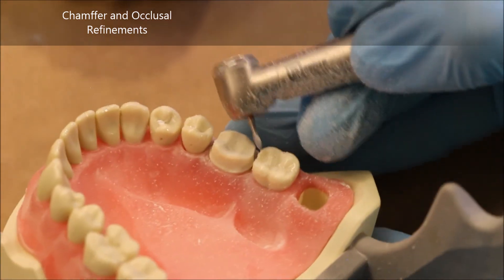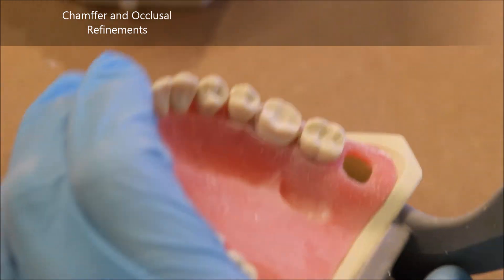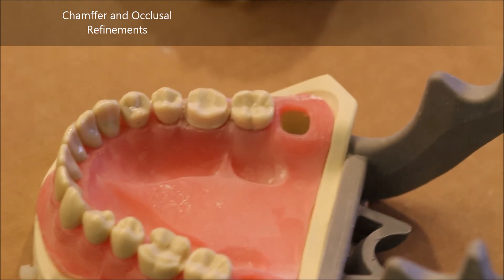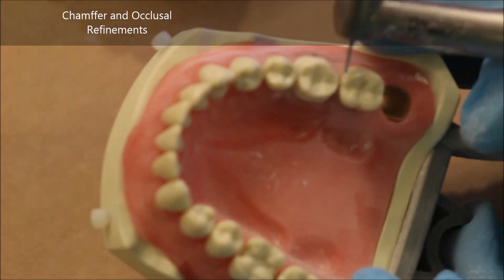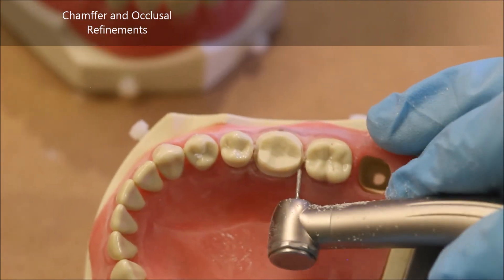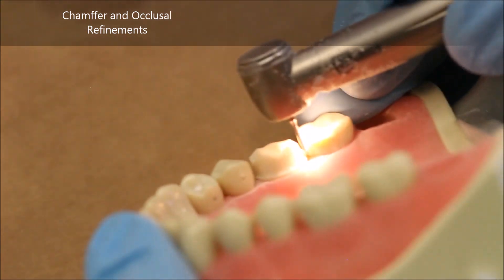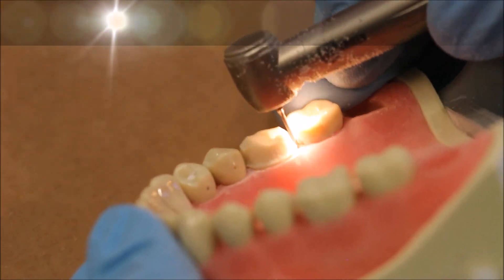The 7404 is also a very gentle burr that can remove sharp corners, especially on the cusp tips, which could not be removed with the 8877. A final check to ensure that occlusal clearance of 1.5mm has been reached, and a quick check of the entire margin shows that in the distal there is one area where the margin is not completely flat. I switch back to my 850 to fix that one small area.